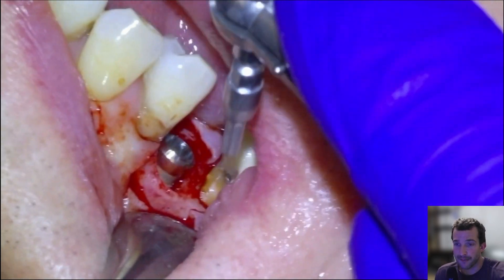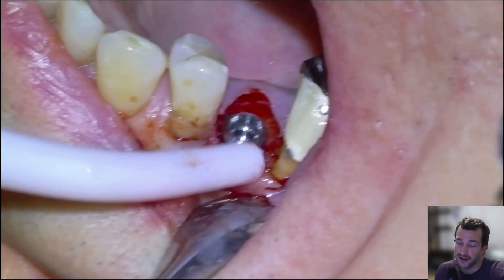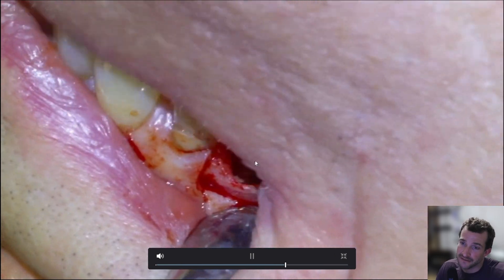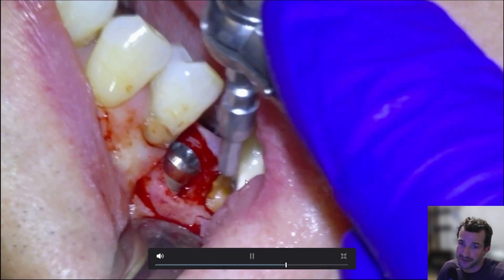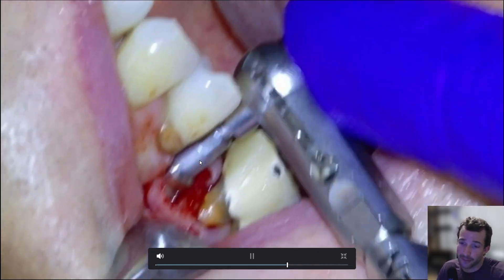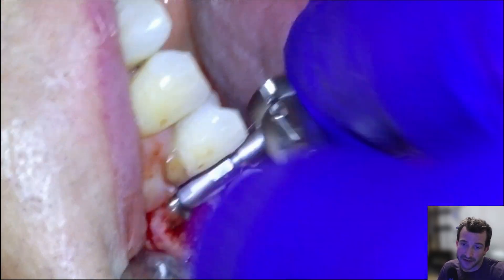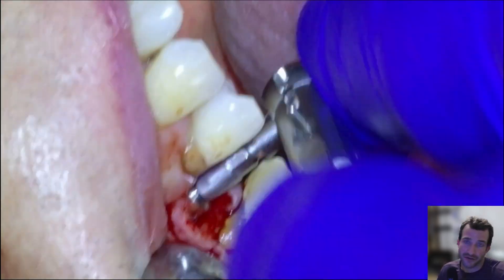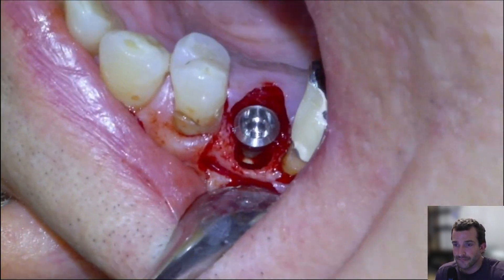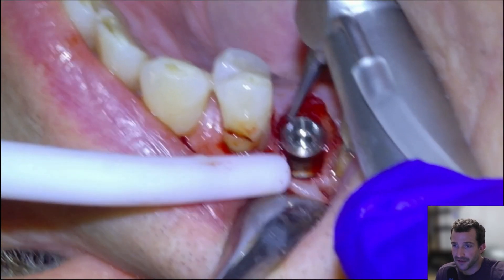You can see the buccal gap — there's an option to put some kind of biologic material in there, but there's a big wall of bone here and that's just going to fill in with blood, which is going to turn into bone. I know that because I've left cases like this with a huge buccal gap, then went back in and laid a flap just for inspection purposes, and sure enough bone does fill in. We'll screw it in. I don't think we placed a biologic — we may have — but in my opinion it's optional.